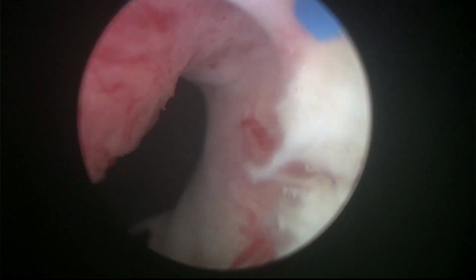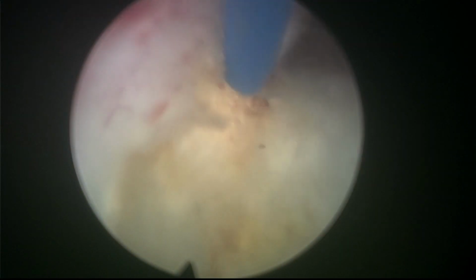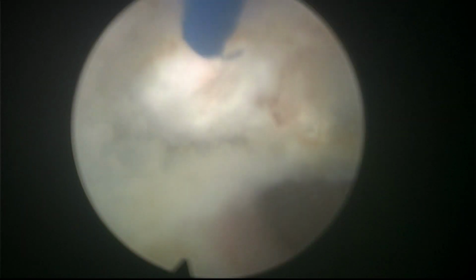Basically look for the reference of the interface between the adenoma and the capsule. You can see it there quite clearly, but of course, often we see that there's a more fibrous quality of the tissue. See, that's the cavity. This is the edge of the sphincter. So trying to mark the anterior part as well. So here, this would be the anterior part. And now the white line is connected, and this is a great reference.